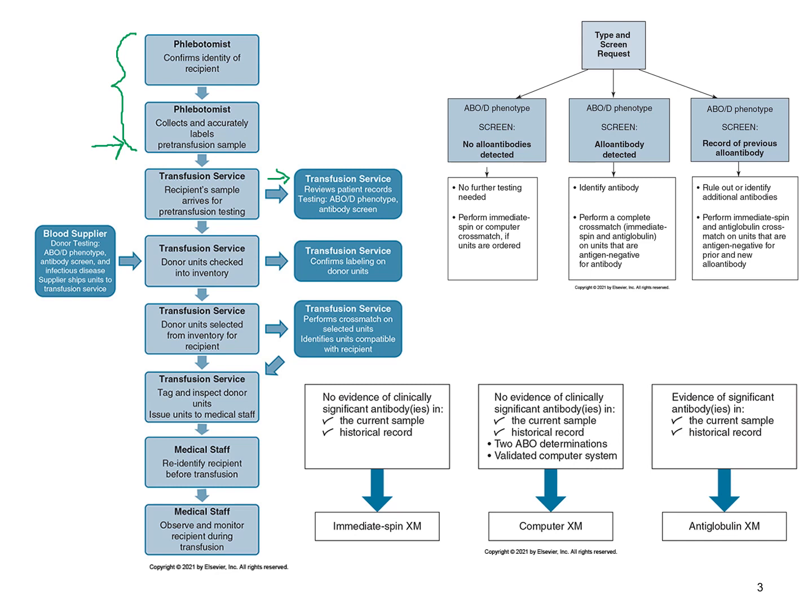Also in transfusion services, the donor units are actually checked into inventory. This is usually a step that is done before you ever get to the point of cross-matching those units with the patient. Some of the steps with the blood supply are going to happen at a blood supplier, something like the Red Cross or whatever blood services may be available in your area. Or if you are a facility that actually does the collection of blood products and processes those, then this may take place at your facility, so you may participate in this.